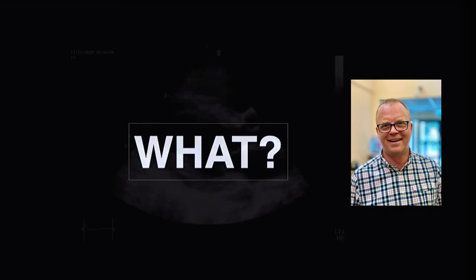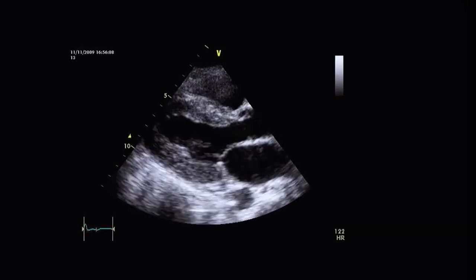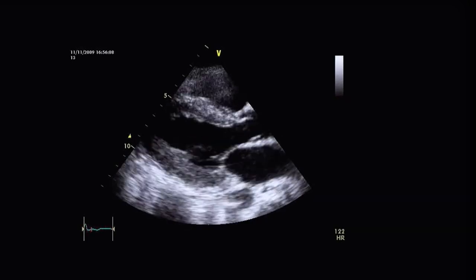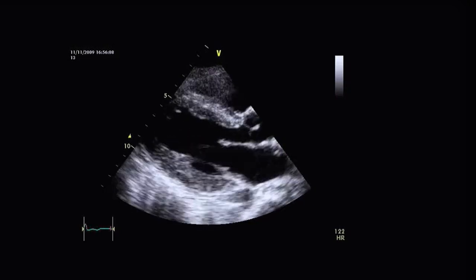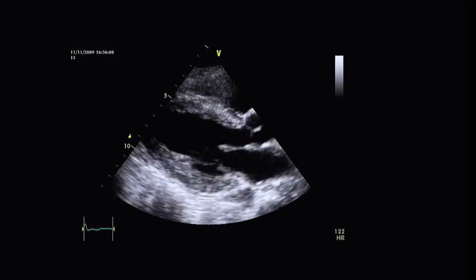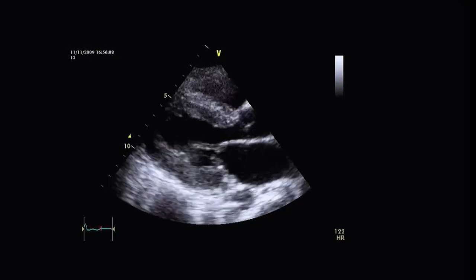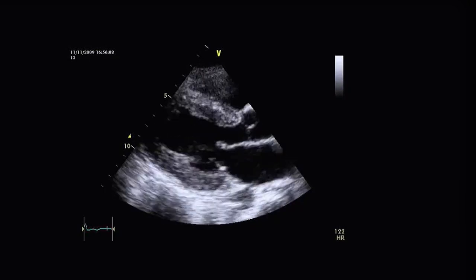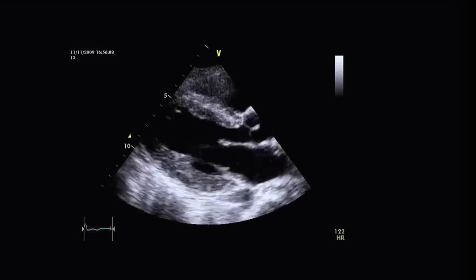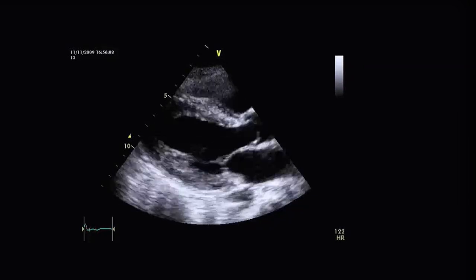So first of all, what? Focused echo is almost entirely 2D ultrasound — moving images. We look at the heart through different slices, and this being the parasternal long axis view it's continuous moving imagery. We do very little measurements, and we can eventually answer questions on a binary scale: is there or isn't there something serious and significant?